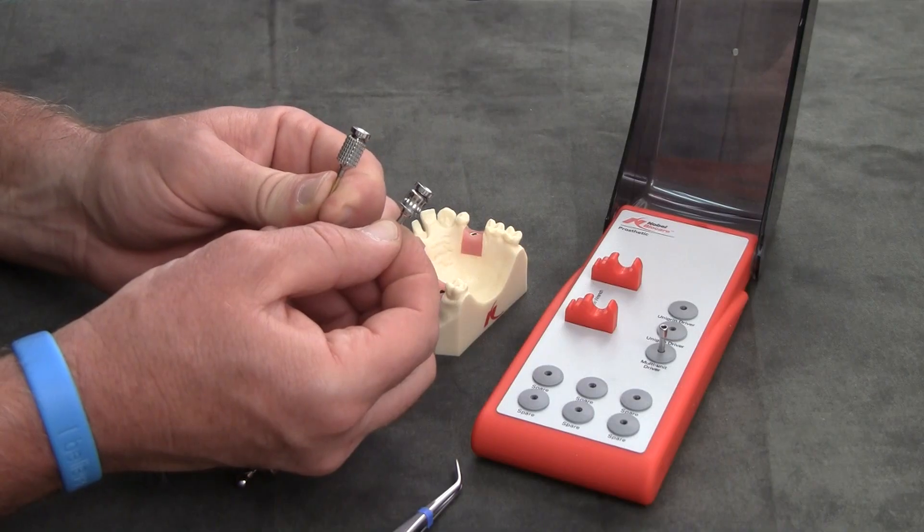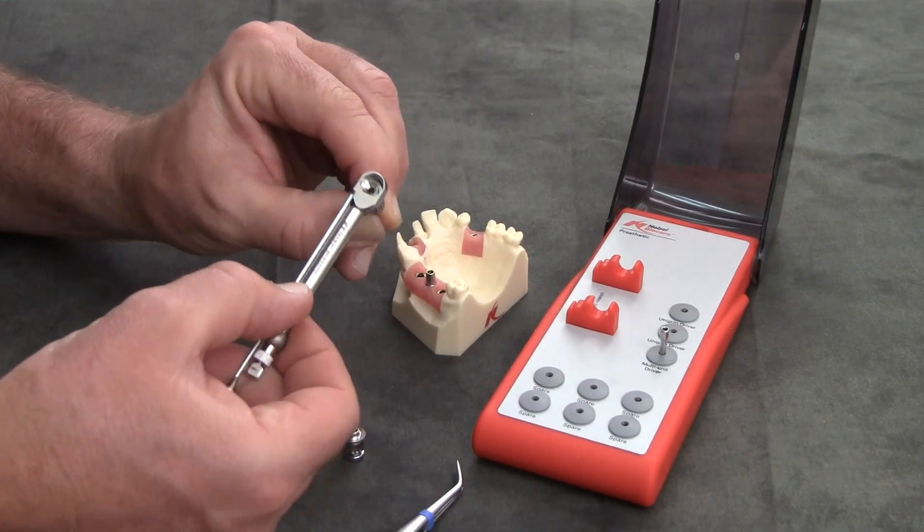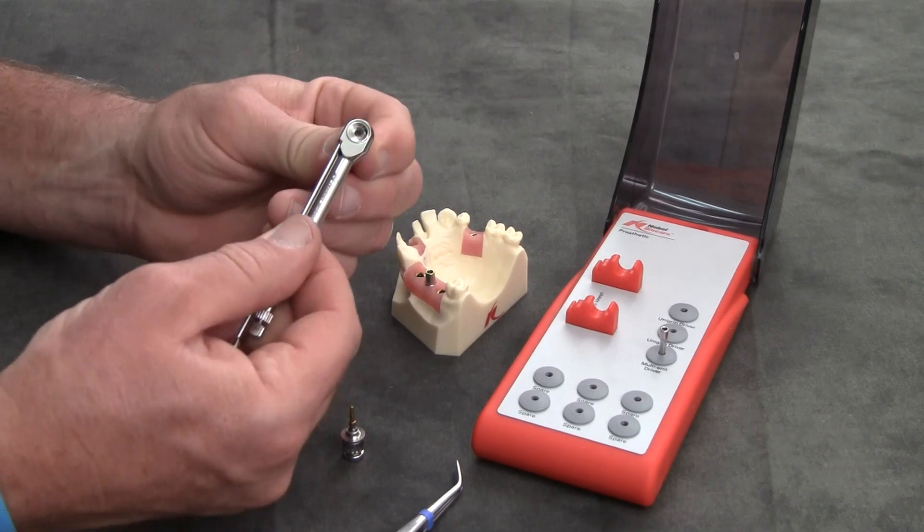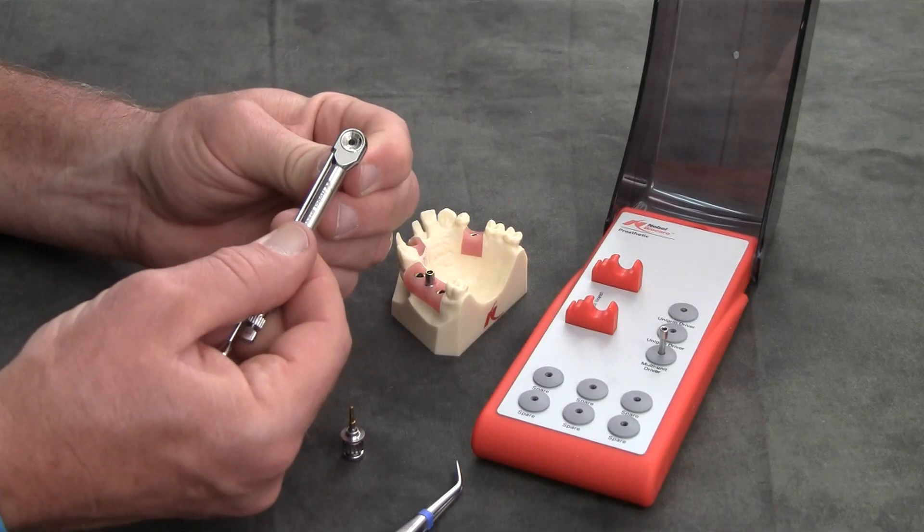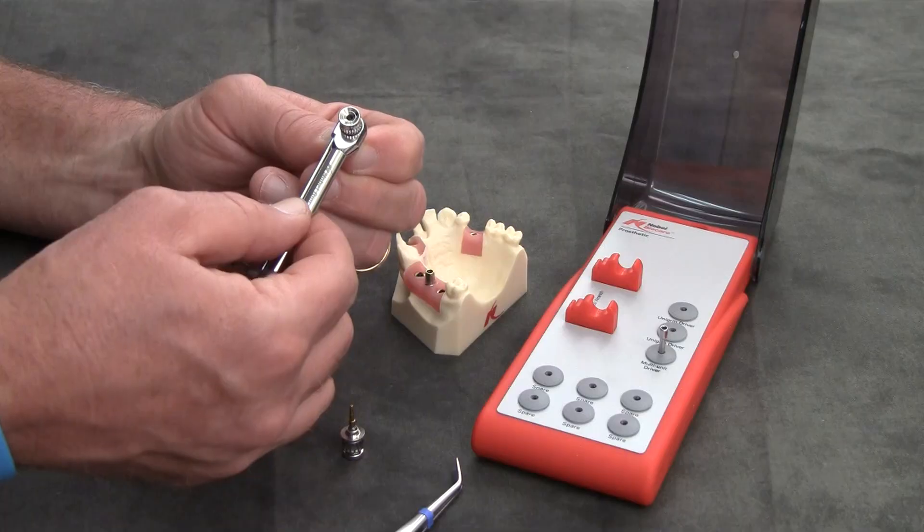But if you try and utilize this manual wrench in the torque wrench, you'll find that it simply slips and won't properly engage. There's no stop, and you can barely hear a little ratcheting, but it will not engage completely.